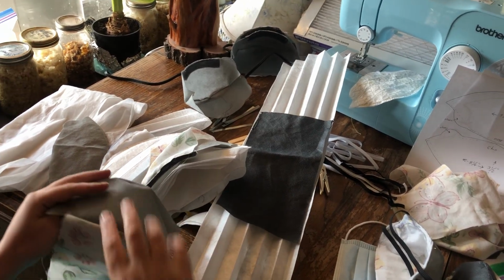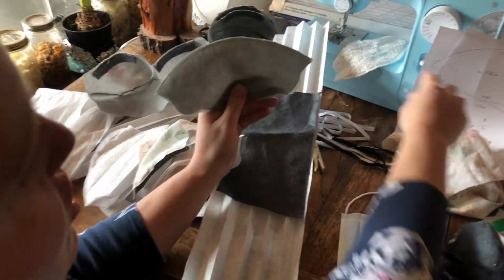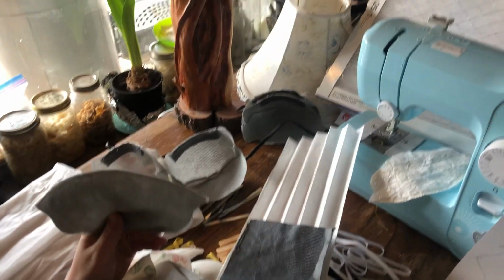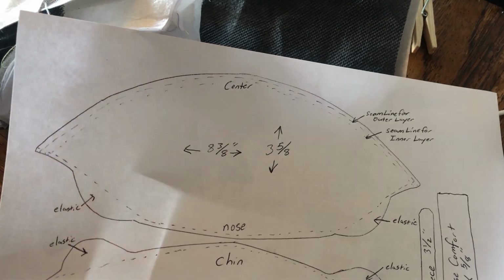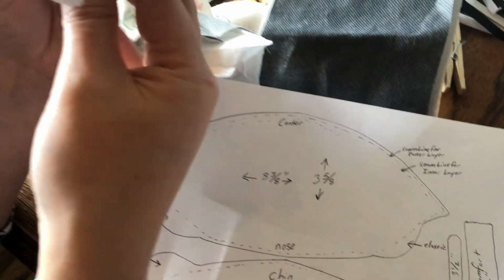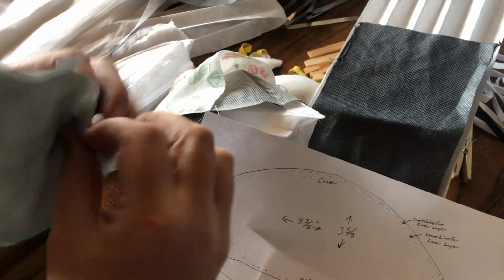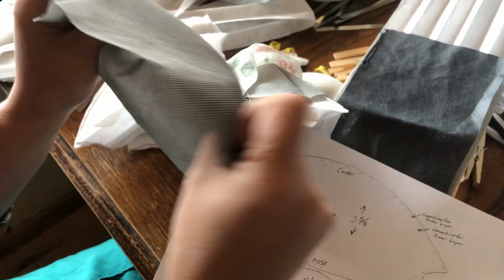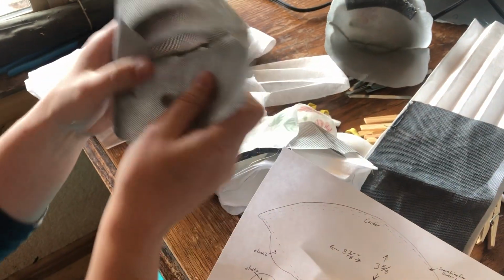So there's my outer layer. I sew that. Here I showed how on my pattern I sew the outer layer on the outer line to make it just a wee bit bigger than the inner layers, because the inner layers have to fit inside of it. Then I turned it inside out. I sewed on my nose piece and my cloth so that it can come inside.